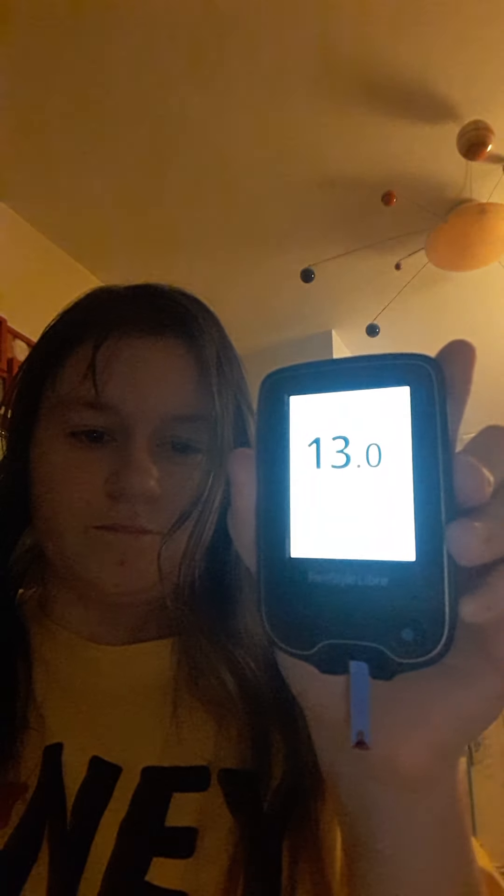Checking my blood sugars with the finger prick is not so bad after all. Here's the Freestyle Libre device — it says 'apply blood.' And here's the finger pricker; I have it set on number two. I'll show you: get the blood down into the finger — one, two, three — and there it goes. The reading shows they're pretty high but it's alright. See how quick that was? It only felt like a little pinprick, because that's basically what it is.